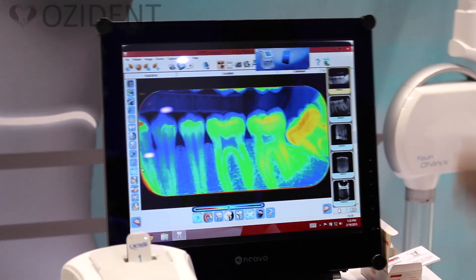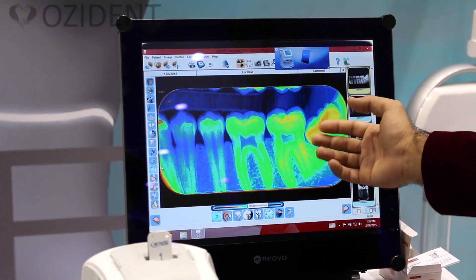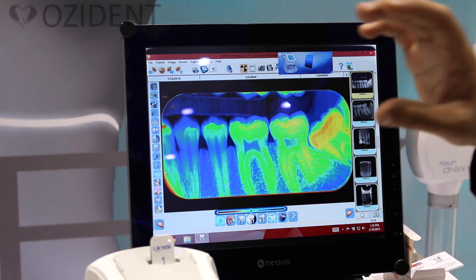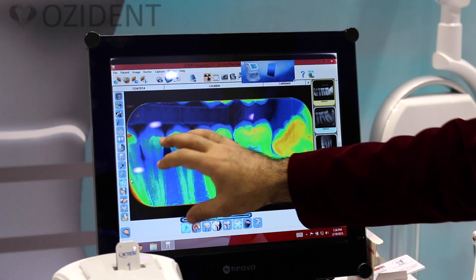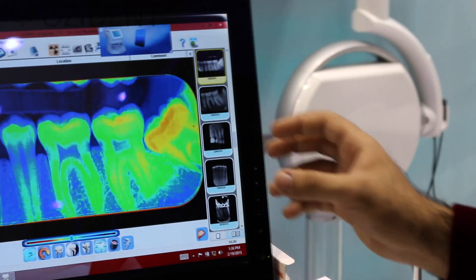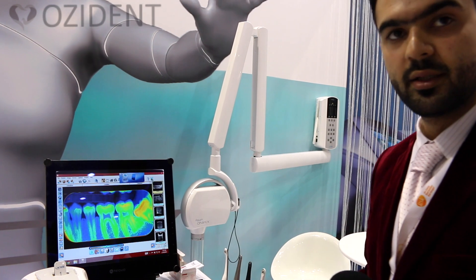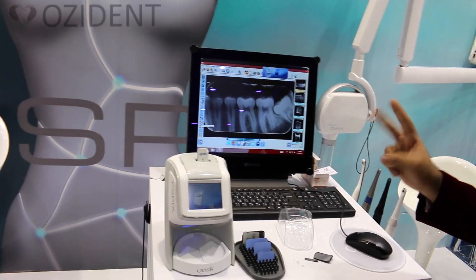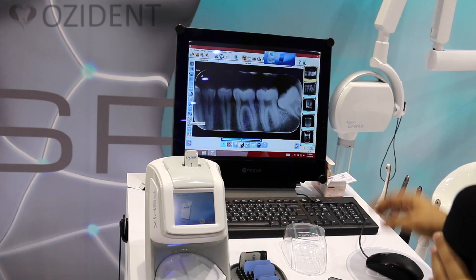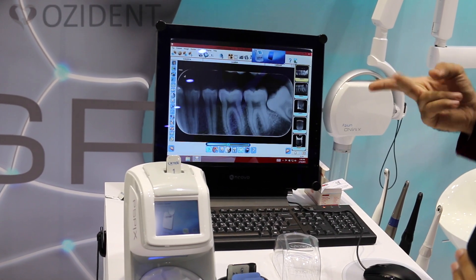Here you have the pseudo color option, where a color is assigned to every part of the whole image based on exposure level — unlike the flashlight which only affects a selected area, this affects the whole image. Then there is the flip option, which lets you mirror the image symmetrically left or right, or up and down.